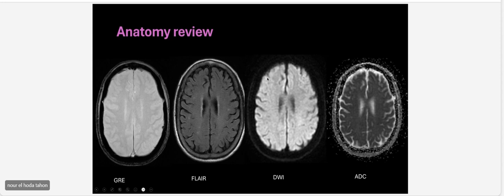And the diffusion can tell you something about that. So for example, in a stroke, when the tissue has died, right? And the sodium potassium pump stops working, there are edematous changes, like swelling of the cells because there is no exchange of molecules, right?